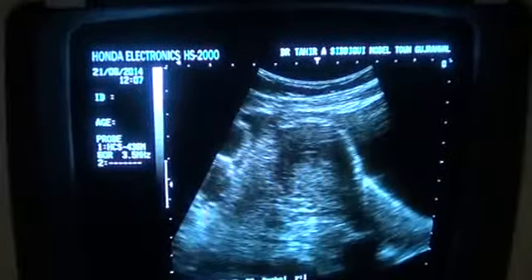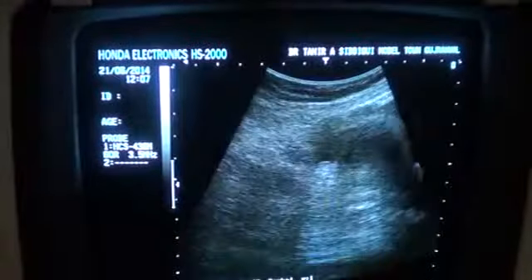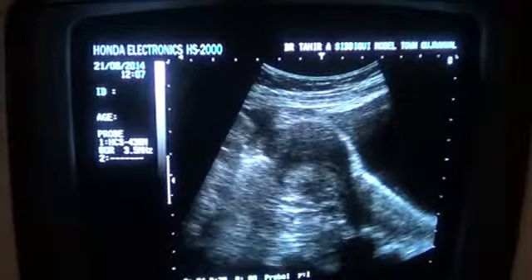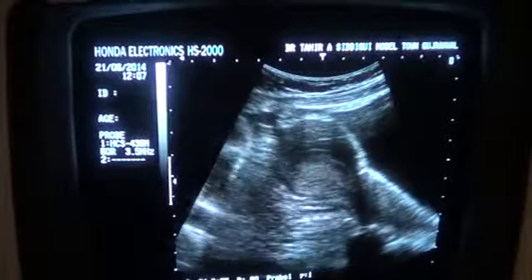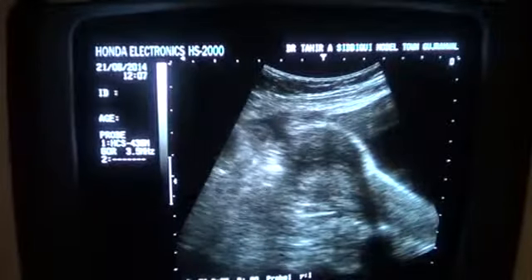This is an ultrasound study of a 24-year-old married female, para 2, two kids. The last kid's age is 7 years, and she has presented with the complaint of secondary infertility.